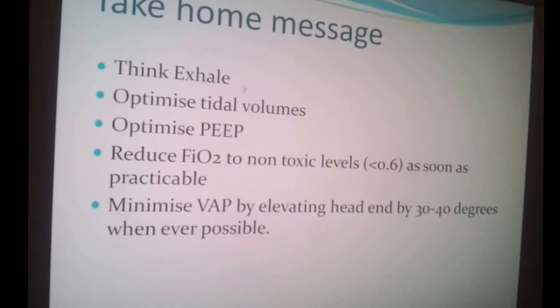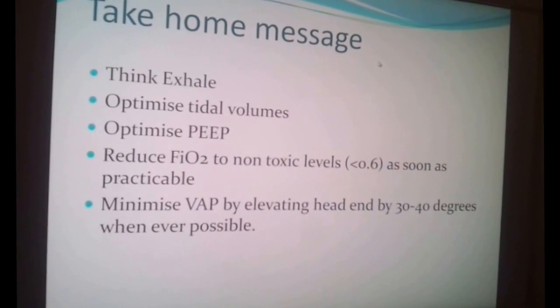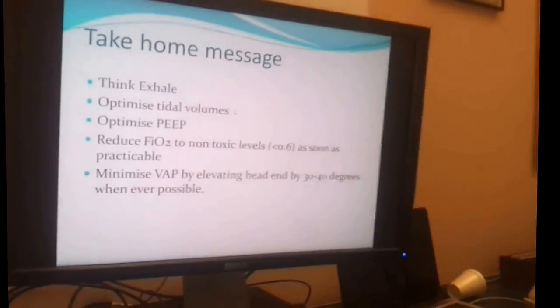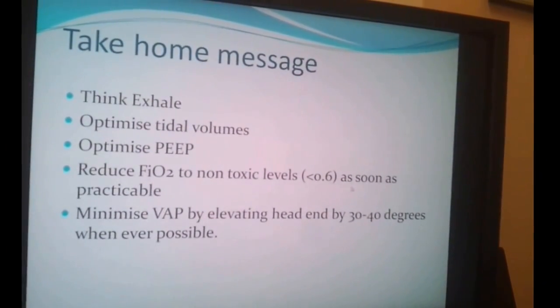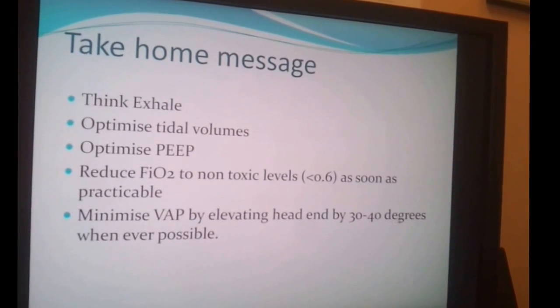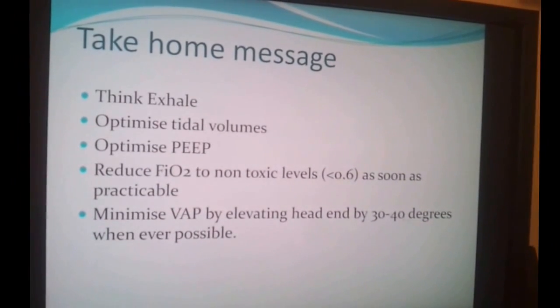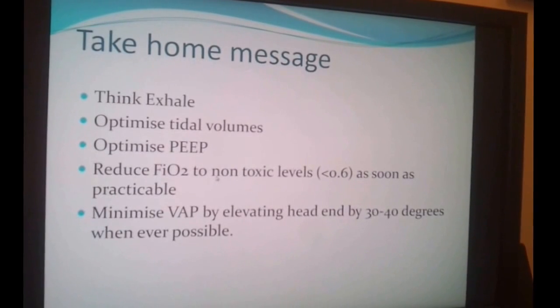Take home message: think exhale, because exhalation is the most important part of ventilation for the patient and to do no harm. Optimize tidal volumes. Always think, if you're changing something, could you be causing harm? If you think in that way, you will probably remain with more conservative management. Optimize PEEP. Reduce FiO2 to non-toxic levels and do the best by the patient. So increase their head end to 30 to 40 degrees if you can. If the patient is a trauma patient intubated with a hard collar, put them in reverse Trendelenburg position, like a board, so that you elevate their head.